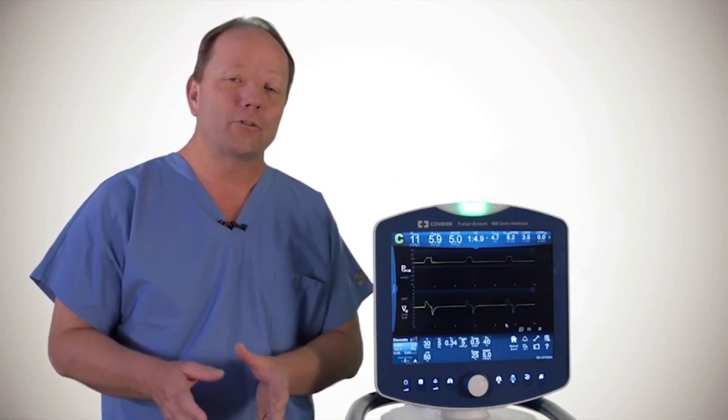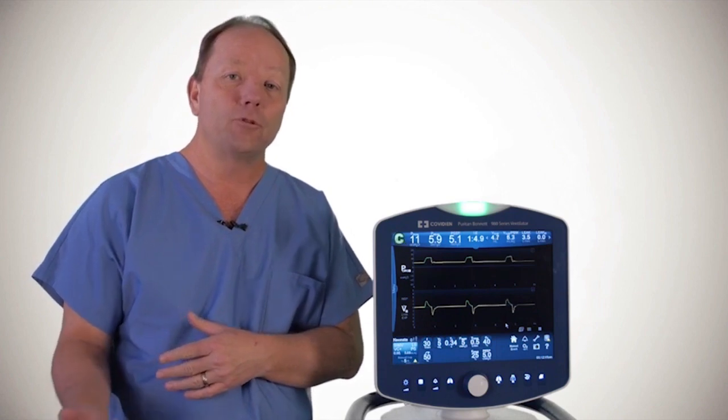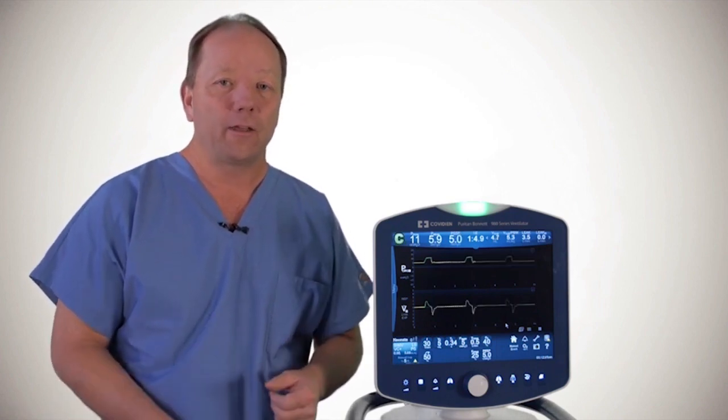There are constant purges going on to remove water from the circuit line, but you can also go in and do a manual purge, and I'll show you how that is done.